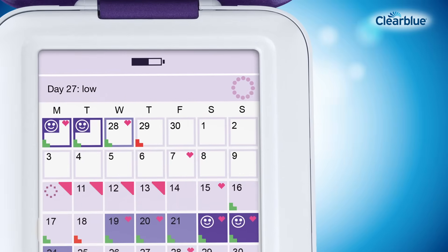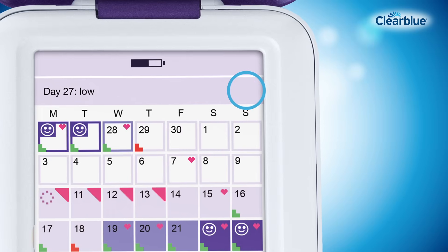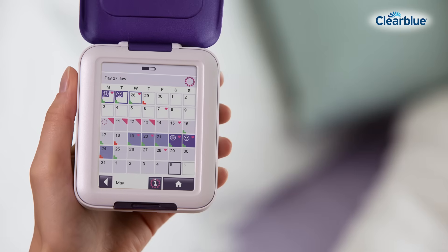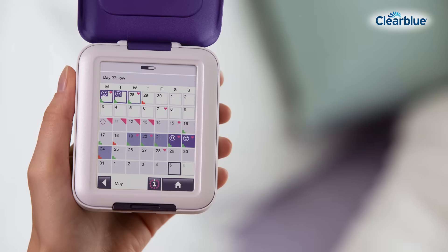Usually a few days before your next period is due, a flashing symbol will appear, indicating you are approaching the end of your cycle. If your period starts, you should set your monitor for the next cycle. If the symbol flashes for several days and you think your period is late, you may be pregnant.